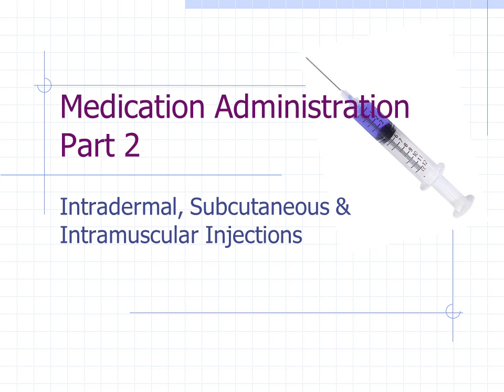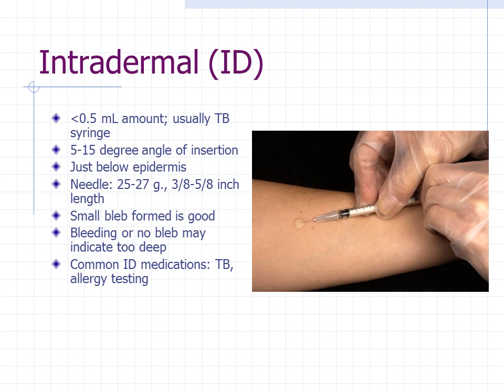Medication Administration Part 2. Let's talk about intradermal injections.